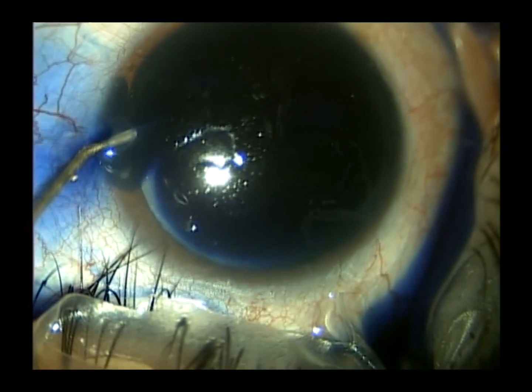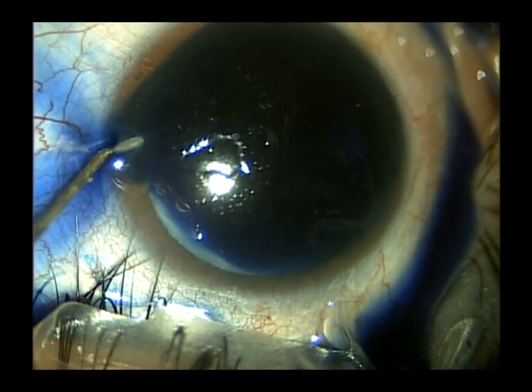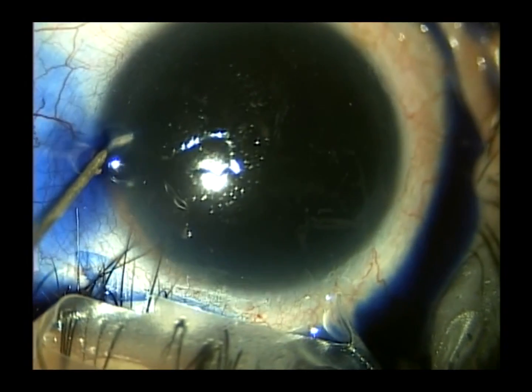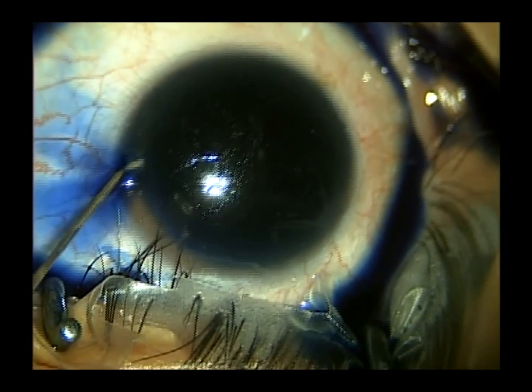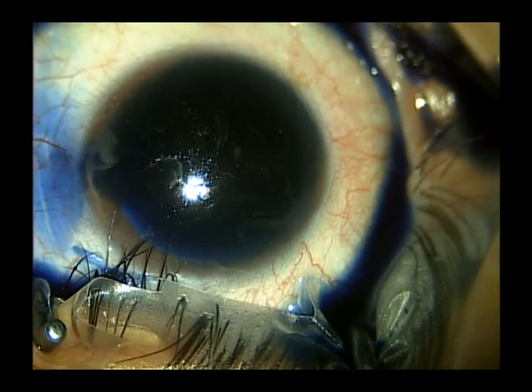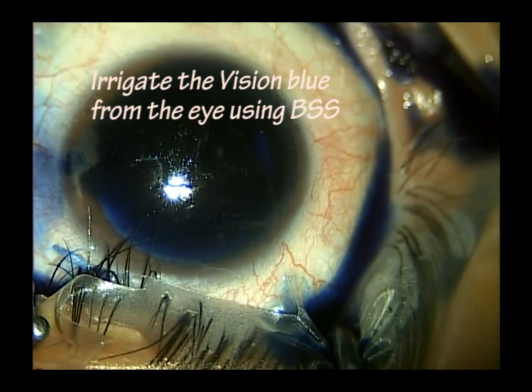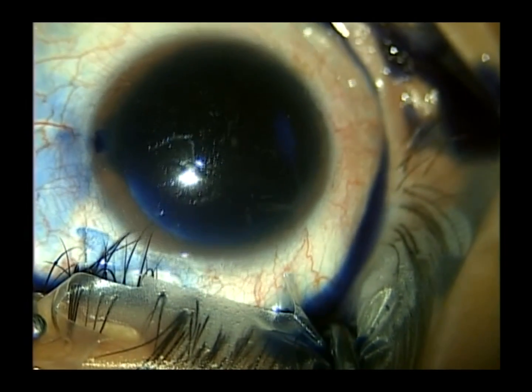It's pretty much impossible to safely create a capsulotomy opening in an individual who has a white cataract. So we stain the capsule to enhance visualization. We don't use an air bubble to protect the corneal endothelium — we just infused the Vision Blue, using pretty much the entire syringe, and then used 5 to 10 cc of balanced salt solution to flush out the Vision Blue from the anterior chamber. Our endpoint is good visualization of the anterior capsule.